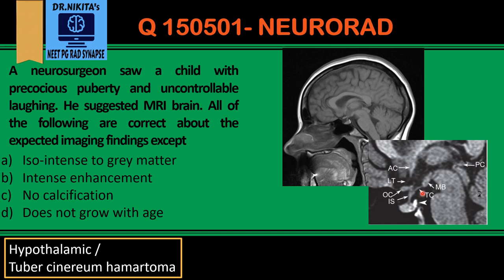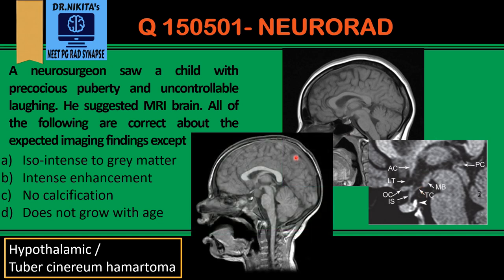A hamartoma is a disorganized tissue in that region, and that is what we see here — a lesion in the region of tuber cinereum. Comparing with a normal image where there is nothing in that region, here we see a well-defined mass. Since it is a hamartoma composed of disorganized gray matter, it will have features similar to gray matter and will be isointense to gray matter.